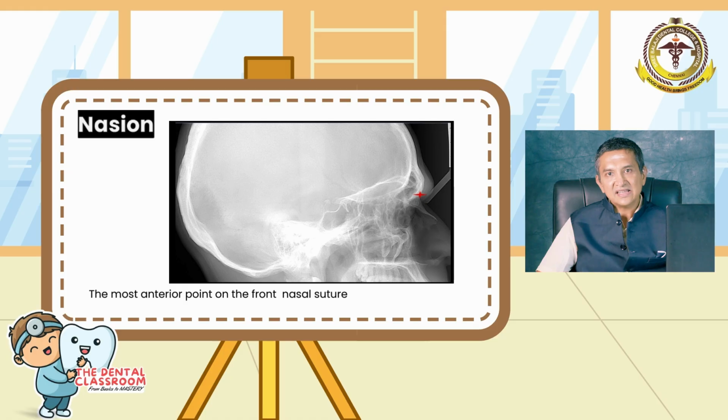This nasion is critical because, from a postgraduate point of view, any anteroposterior movement of the nasion will definitely affect the position of the maxilla and mandible. And what is more important, as a postgraduate you have to understand, is that even a vertical positioning of the nasion can affect the relative position of the maxilla or the mandible.